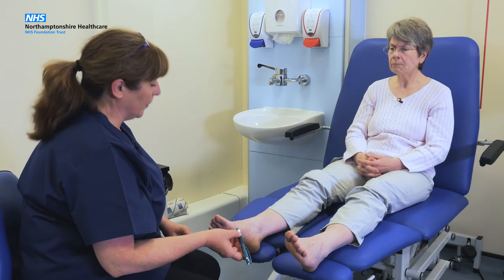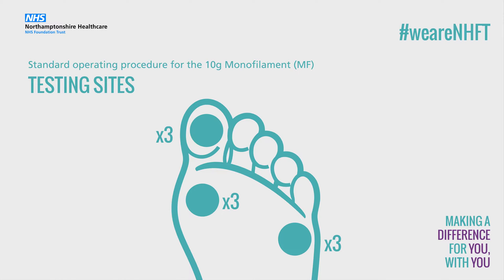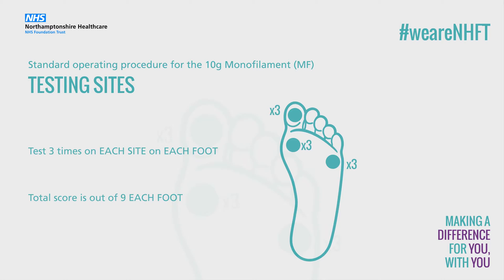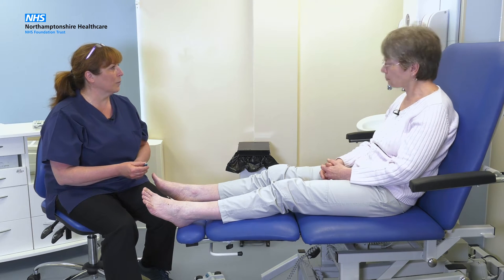If you could close your eyes for me again, that would be good. [Monofilament test performed on second foot.] Okay, Lisa, thank you. That's great. That's that test completed.